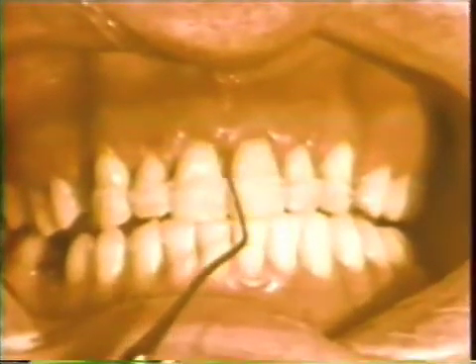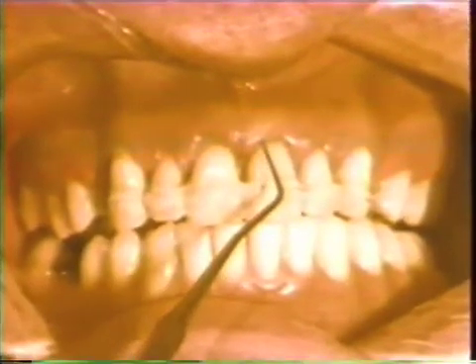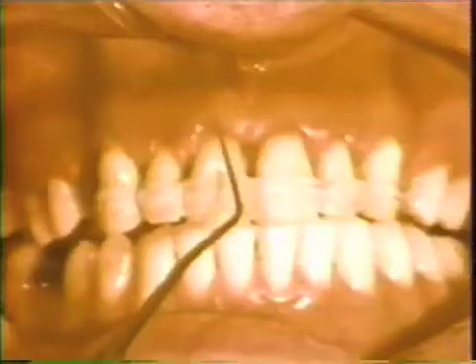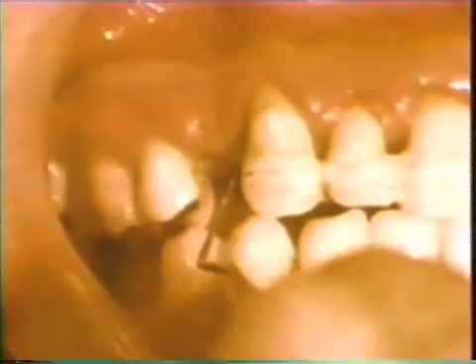One month post-operatively, the tissues appear to be healing satisfactorily. The repair distal to the canine tooth is adequate and minimal sulcular depth is present.